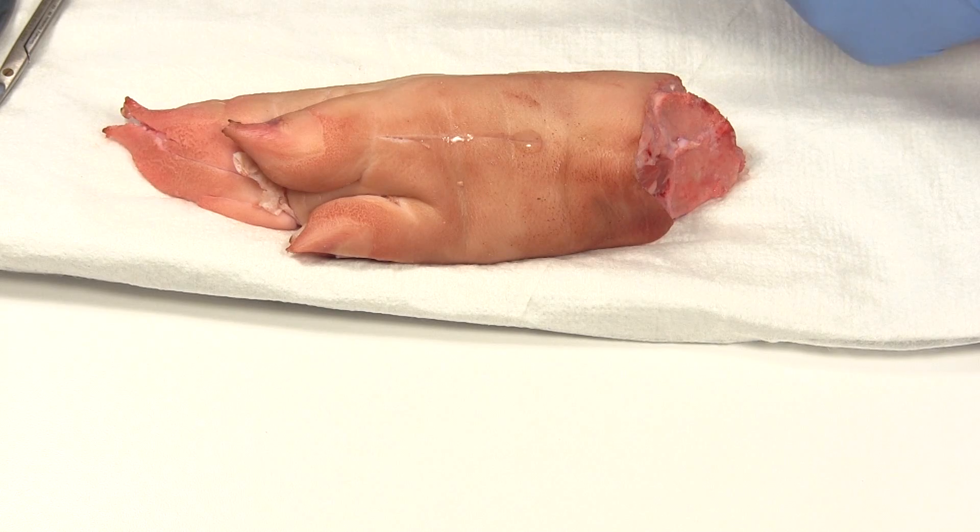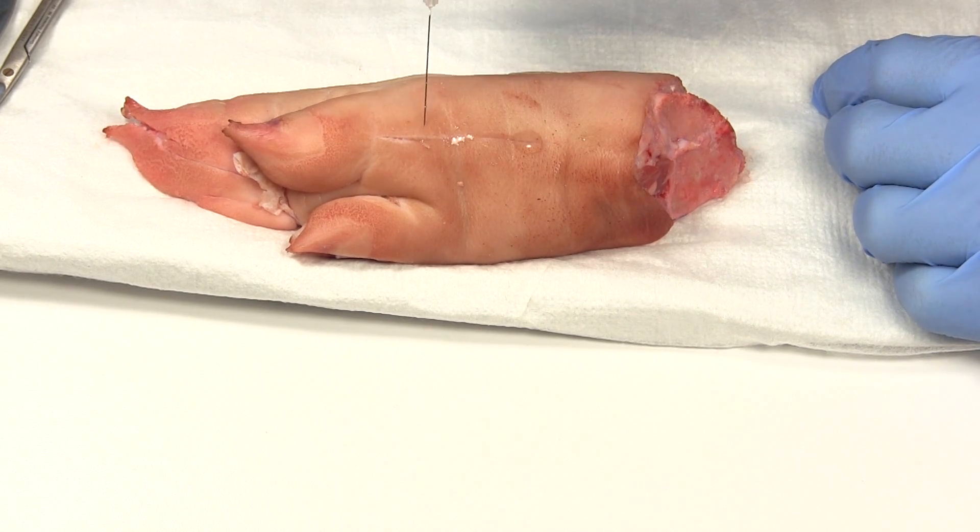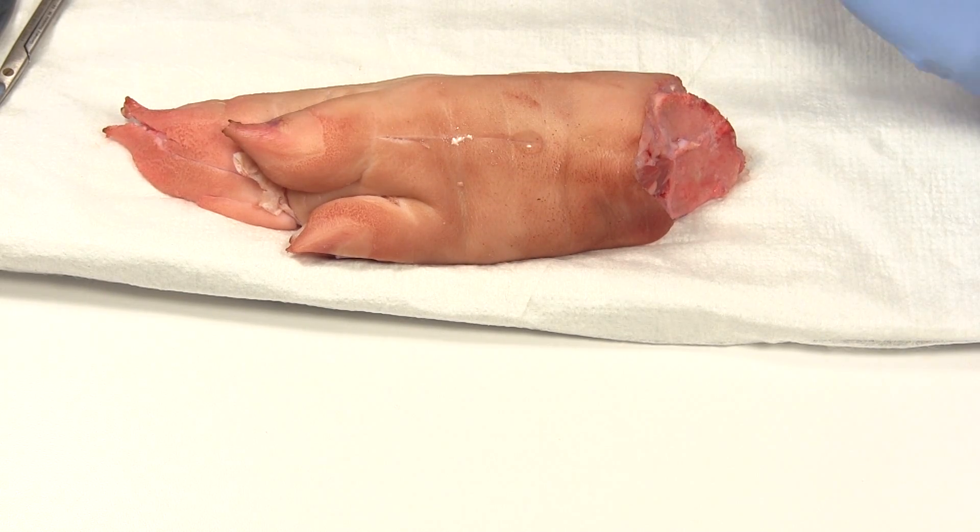Once the patient is numb, sometimes especially with an anxious patient, I'll take the needle and ask, 'Are you numb? Can you feel this?' — just to make sure they're good to go.